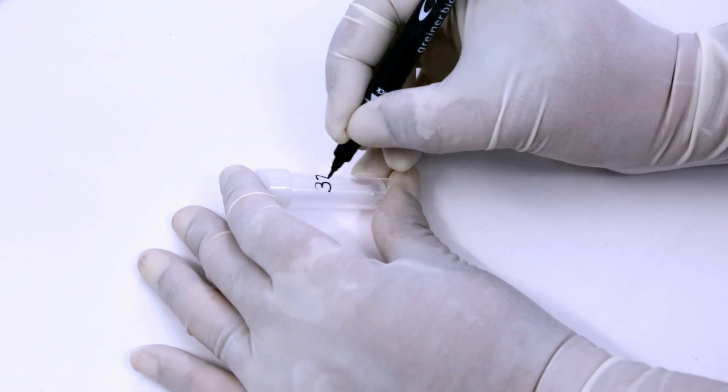Bring all the reagents to room temperature. Label the microtube with ID.